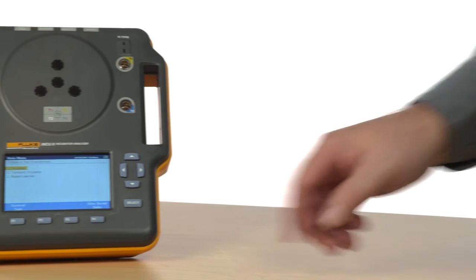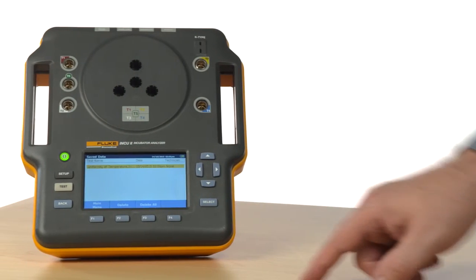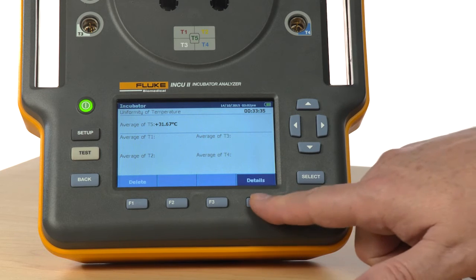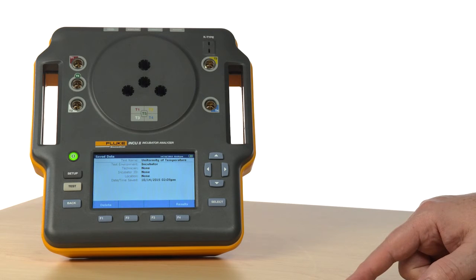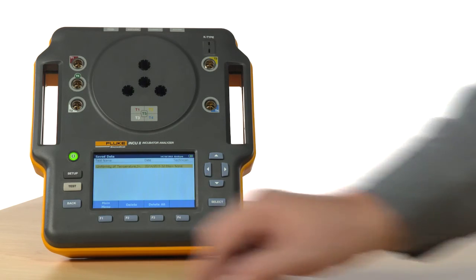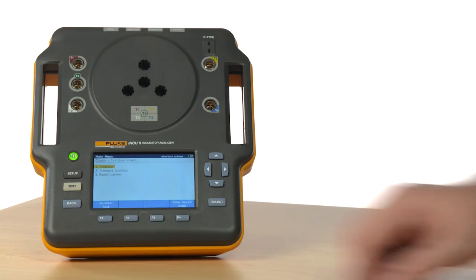After running a test, be sure to save the results. The results will be saved to the device and its onboard memory. They can then be uploaded to your computer wirelessly or by using a USB cable. Ask your sales representative for more information about wireless capability in your country.